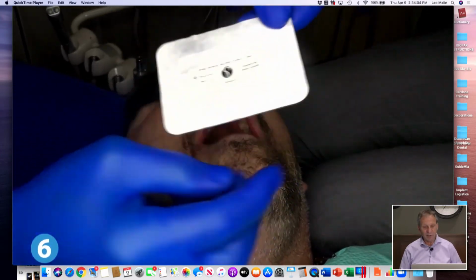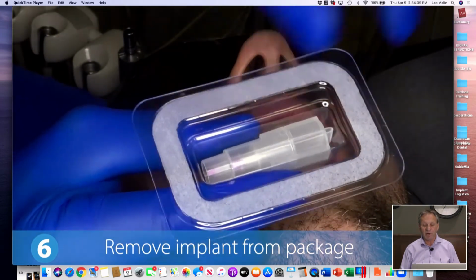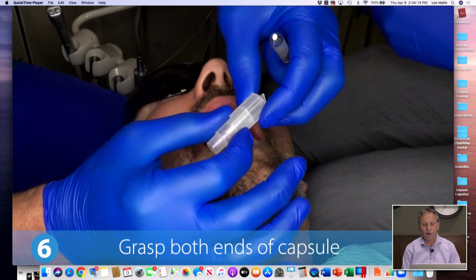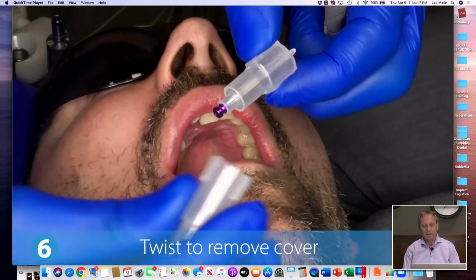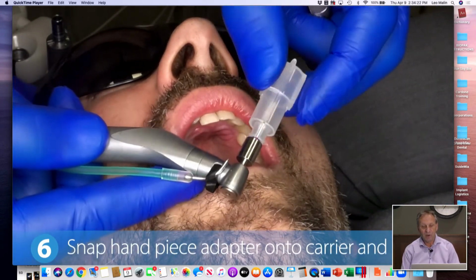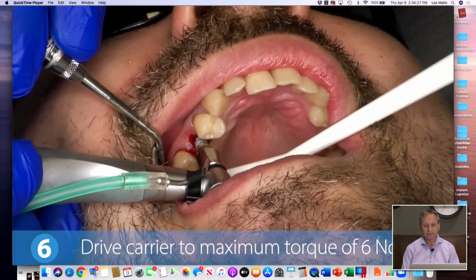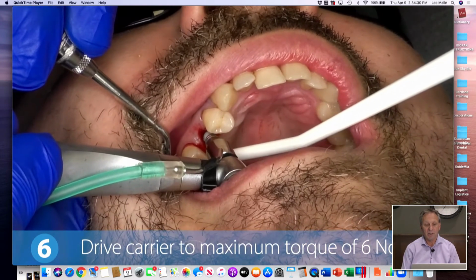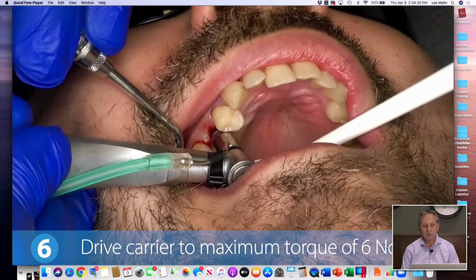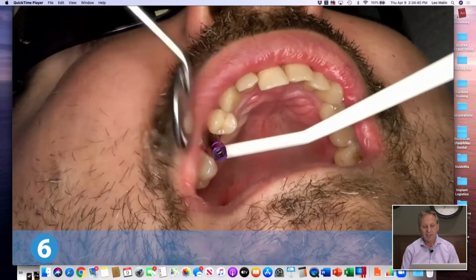So this happens to be the new Implant One series. Can't read it. Series, I'll tell you in a minute. Series 400 because it's purple. So the Series 400 implant is at least a 4.0 or bigger. Comes packaged similar to the way the initial implants were packaged onto the driver. And we're just going to drive this implant in with the motor-driven handpiece. So here is our implant placement. And then once we get the implant close to the tissue level, if it torques out, take off the transfer.